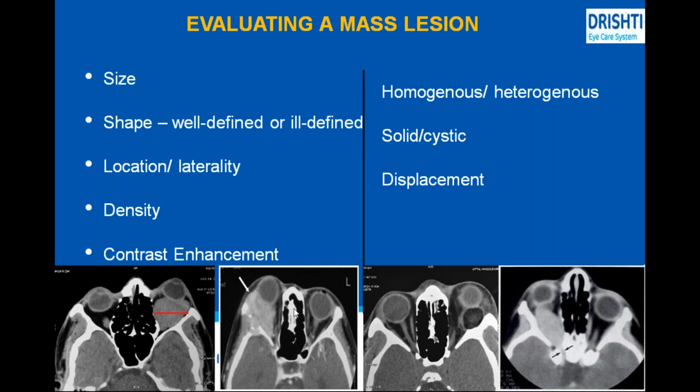Laterality, which eye? Either it is the right eye or the left eye. So which eye is involved, that has to be seen.